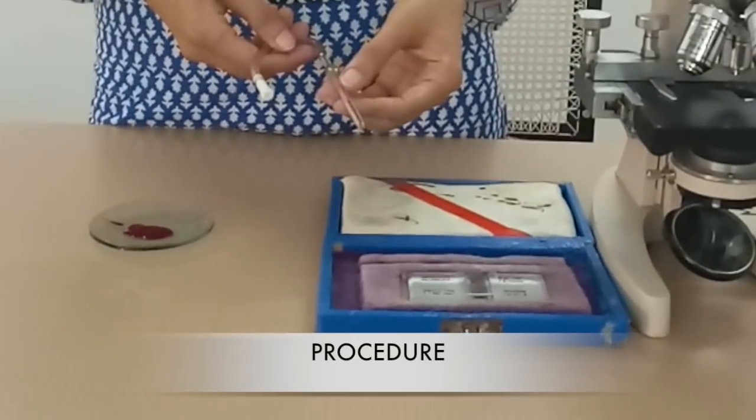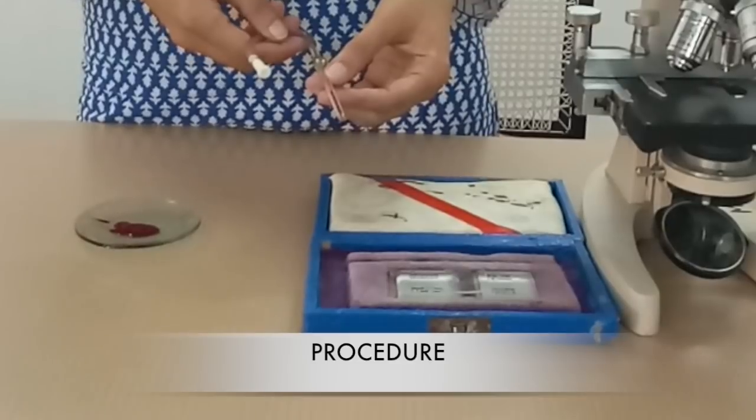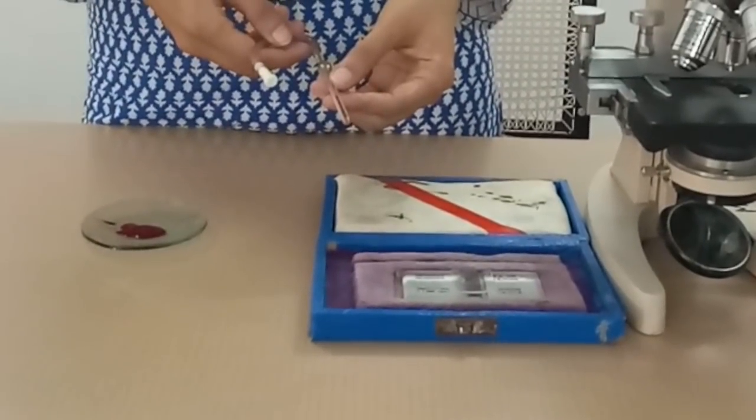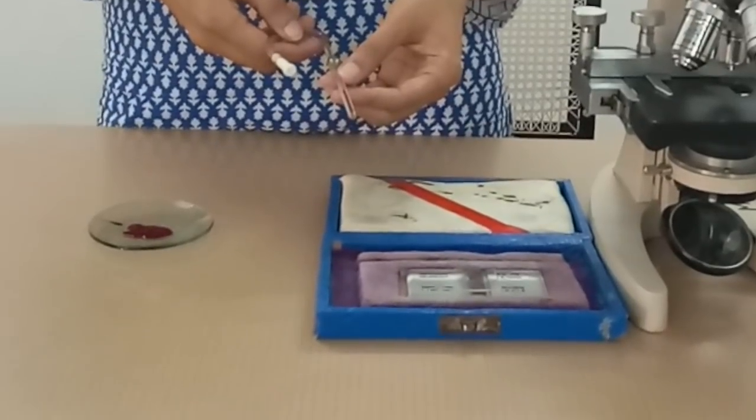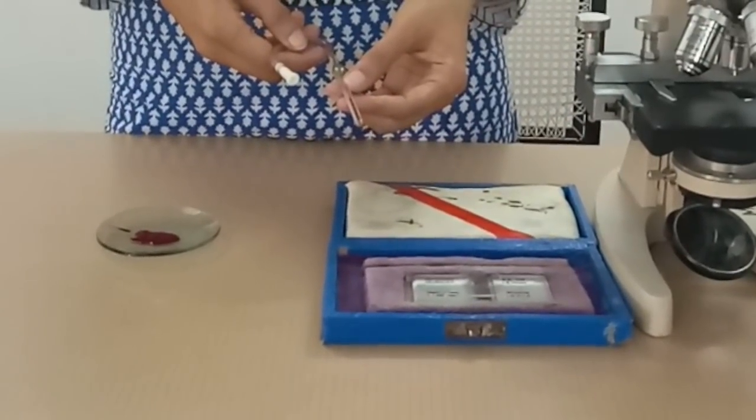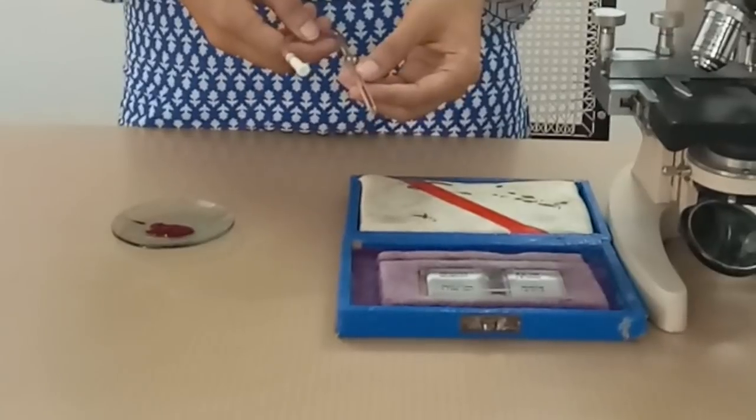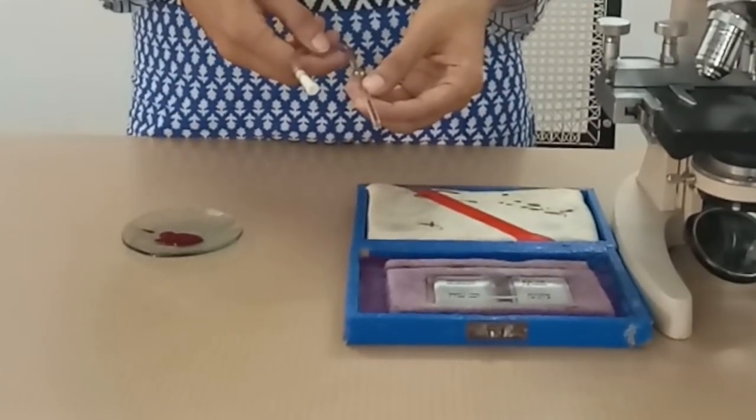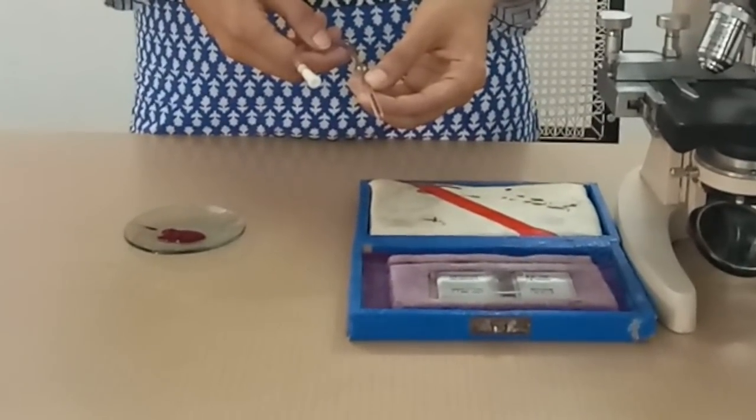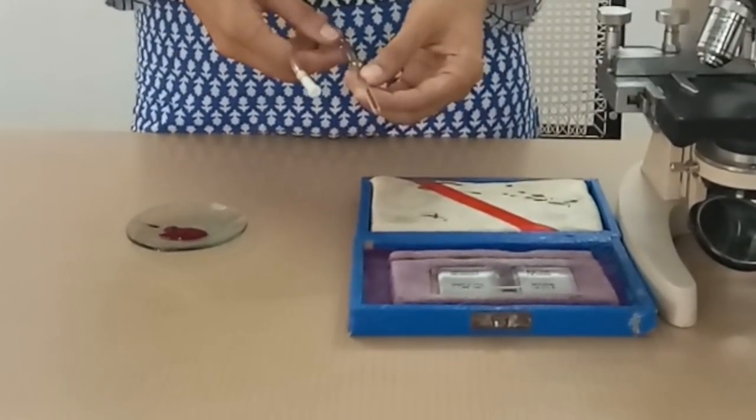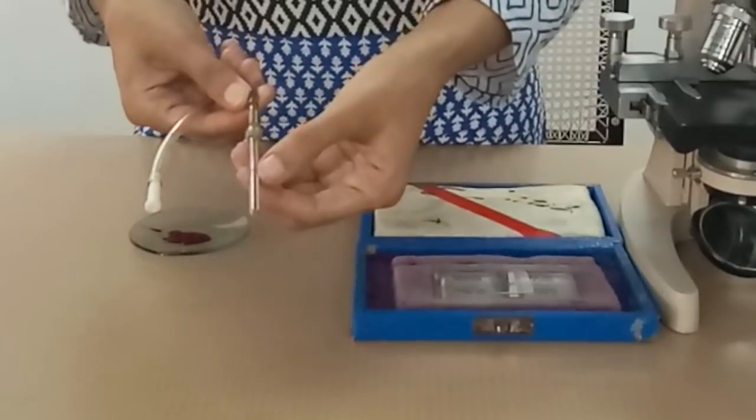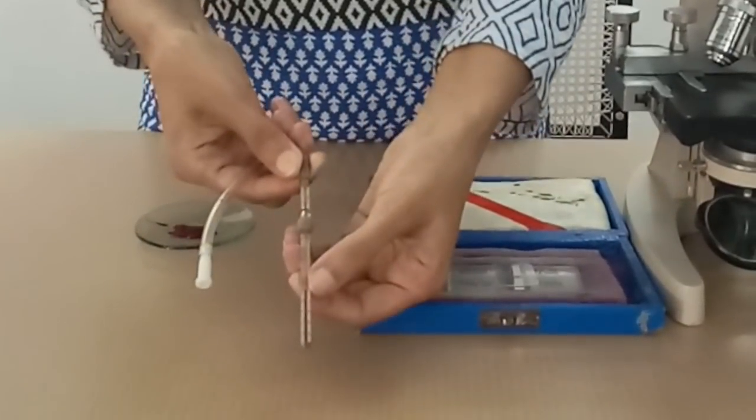Procedure: with all antiseptic precautions, get a finger prick, discard first two drops of blood and let a good size drop to form. Here we are using collected sample of blood. Now dip the tip of the WBC pipette in the edge of the drop and draw the blood to the 0.5 mark. You can see here we have drawn the blood up to 0.5 mark.